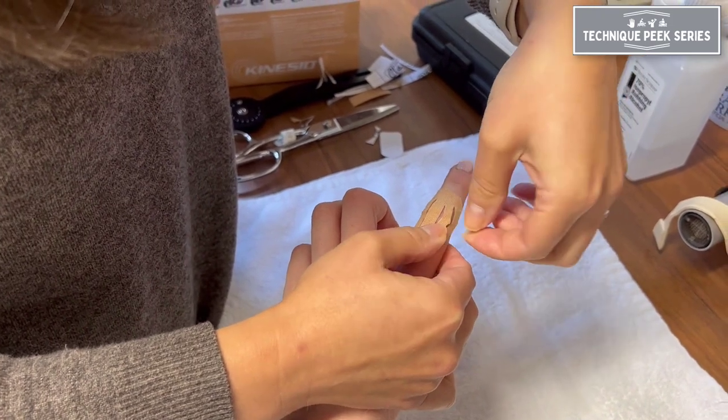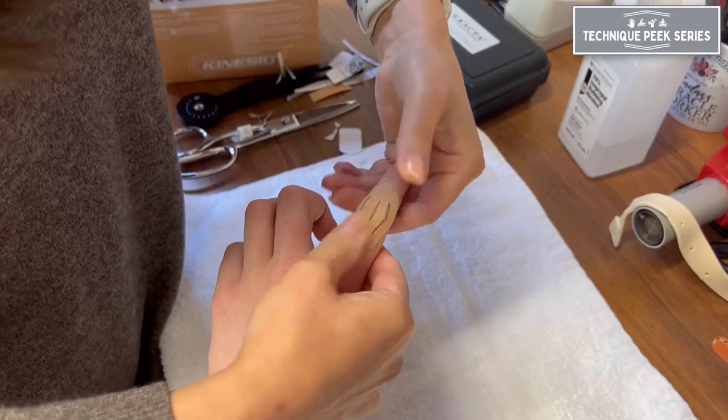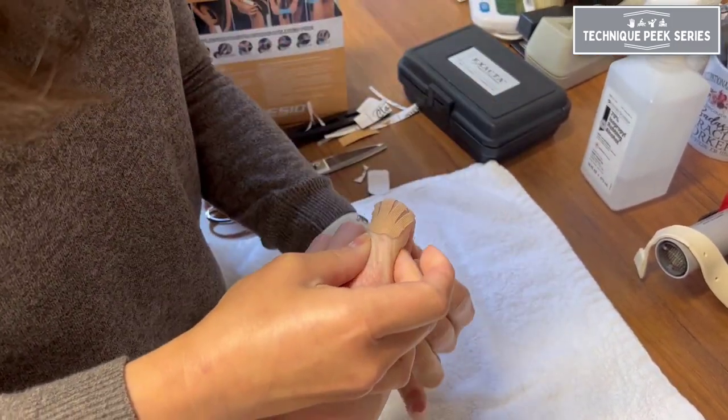This is the therapeutic component of the tape. It's lifting the top layers of the skin and allowing excess fluid to drain out of the finger and back into the lymphatic system.